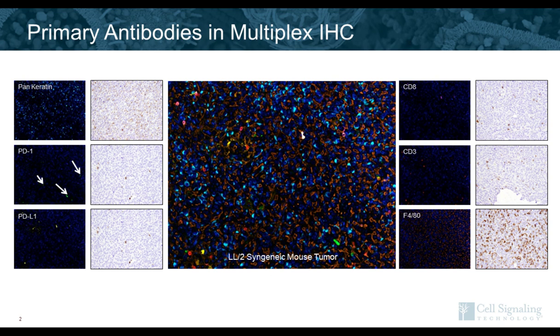Multiplex assays can offer tremendous benefit, such as maximal data per tissue section, which can be critical when working with limited human tissue samples. They also allow for the understanding of co-expression and spatial organization of multiple targets in formalin-fixed, paraffin-embedded tissues in the field of immuno-oncology and can expand the understanding of the tumor microenvironment. In this setting, it becomes crucial that highly validated antibodies are utilized.